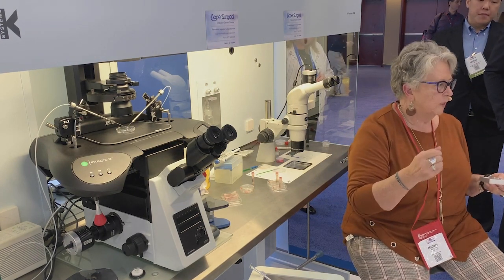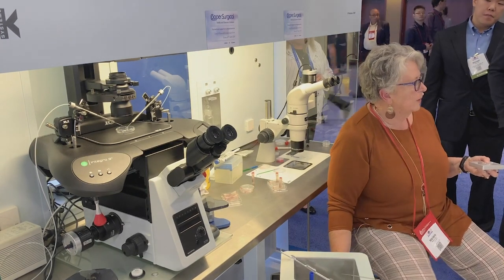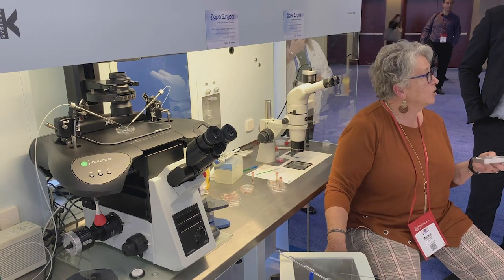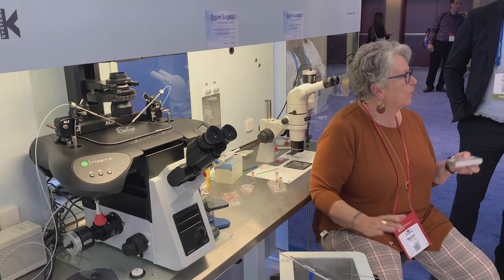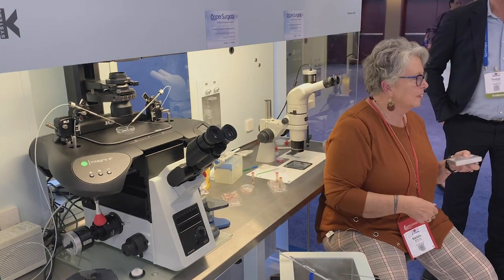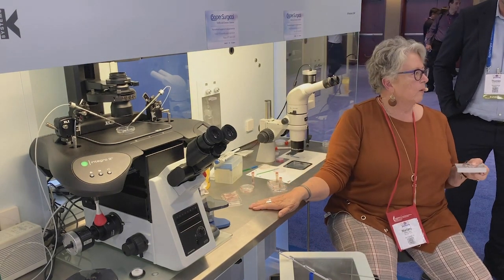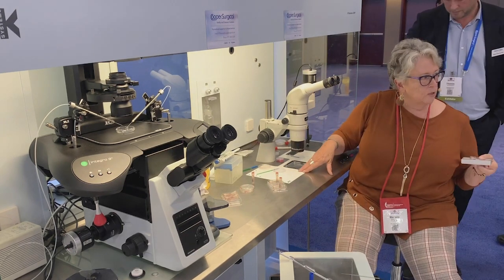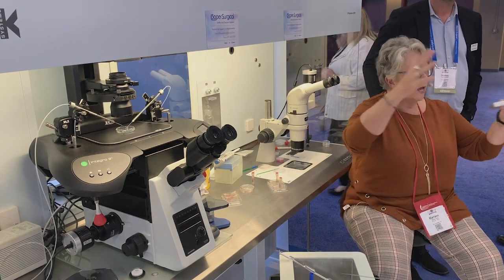and plunge. I usually set up exactly like this, except my second bench is instead of a stool, it's my trash can. I put this on my trash can and set it right beside me. You don't want to walk from the other side of the room to the bench top, and you don't necessarily want it right beside your stage, because it's going to off-gas and drop down onto you.